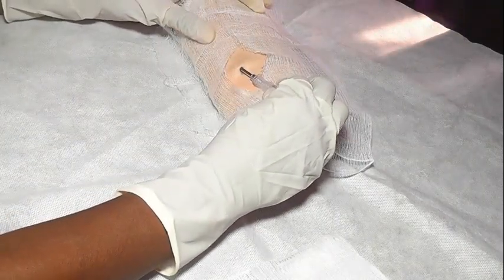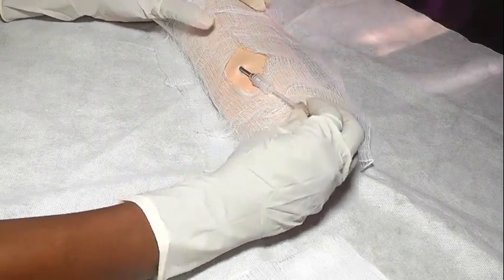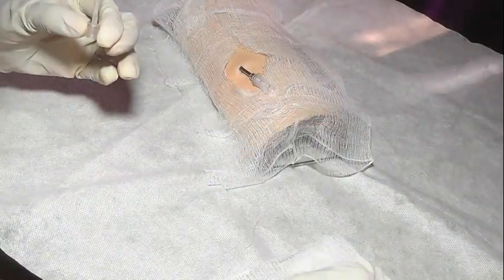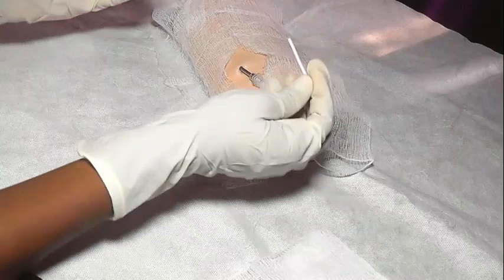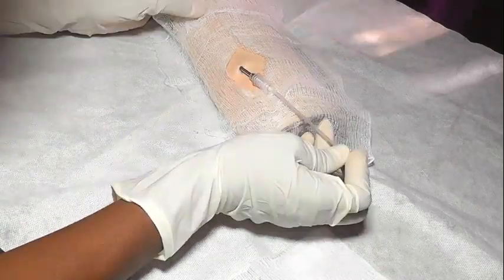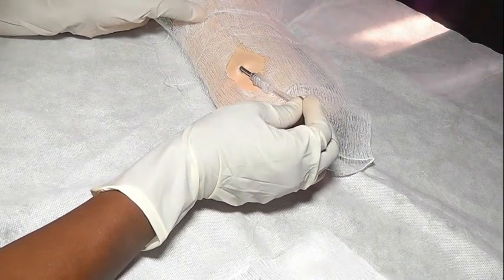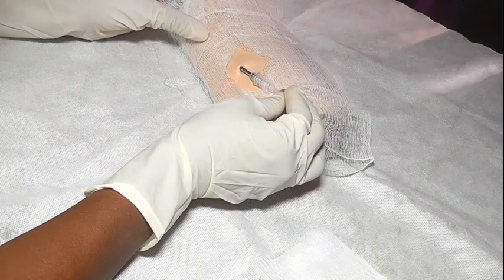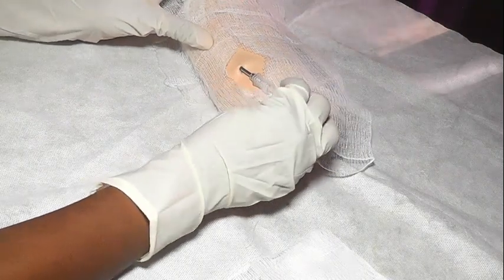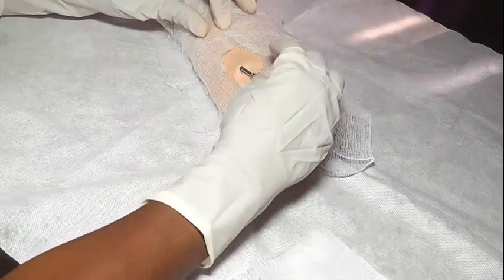I'll withdraw the plunger now, and then I'll pick the second rod and insert it inside. Okay, can you see that? So you gently push, and once you feel a resistance, you stop pushing. Okay, so there's a resistance now, so I'll stop pushing the plunger.